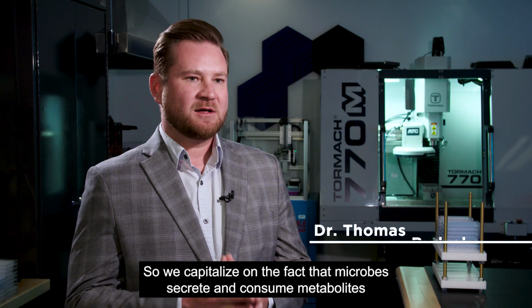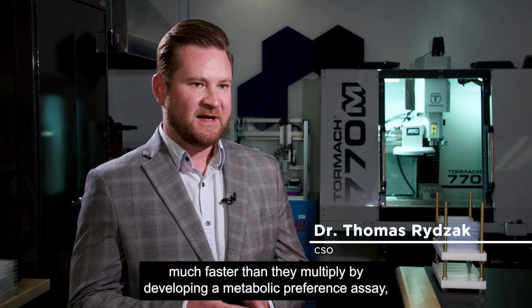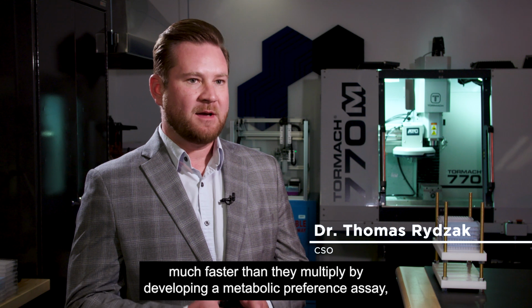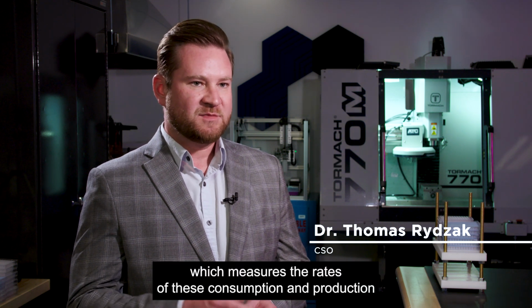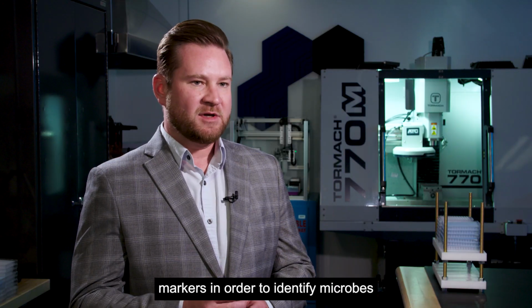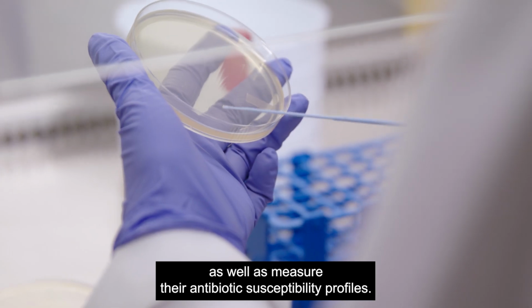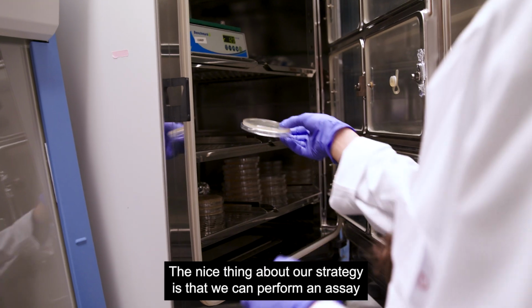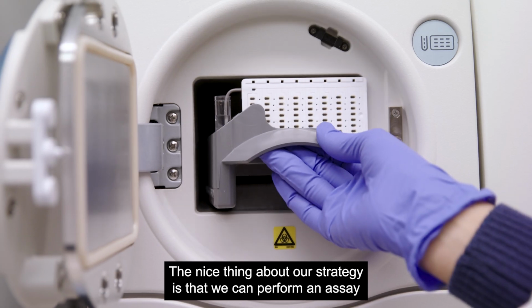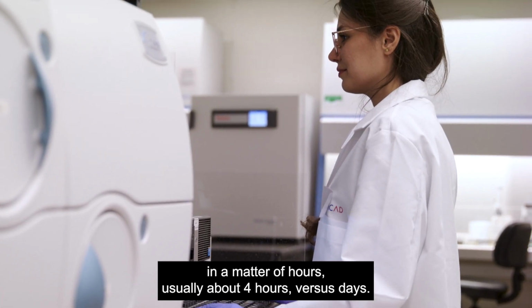So we capitalize on the fact that microbes secrete and consume metabolites much faster than they multiply by developing a metabolic preference assay, which measures the rates of these consumption and production markers in order to identify microbes, as well as measure their antibiotic susceptibility profiles. So the nice thing about our strategy is that we can perform an assay in a matter of hours, usually about 4 hours, versus days.